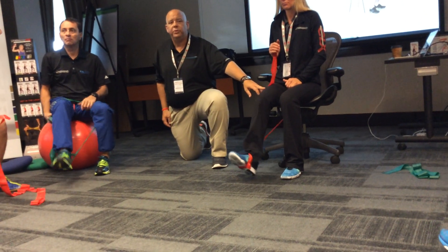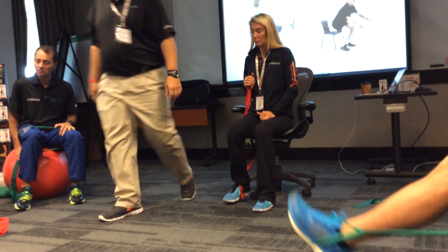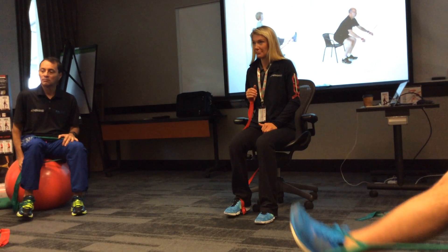This is good for our older adult at home. Yeah, it's a little bit harder.